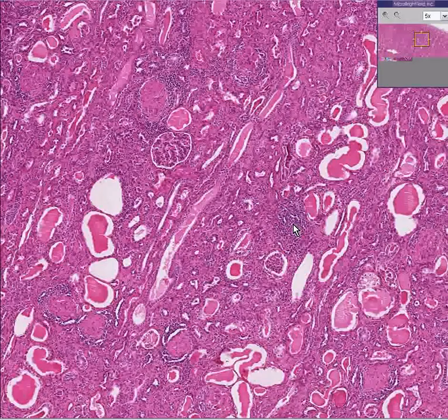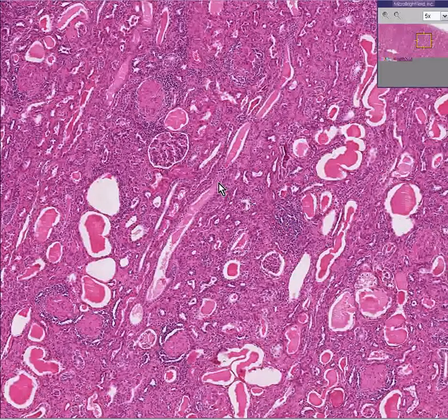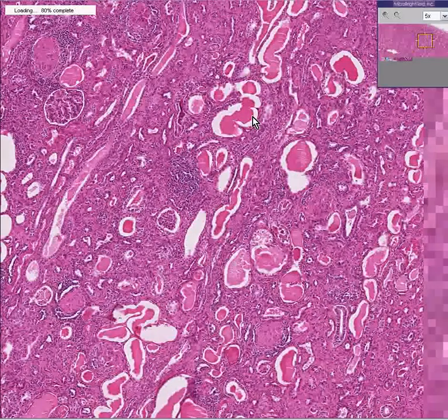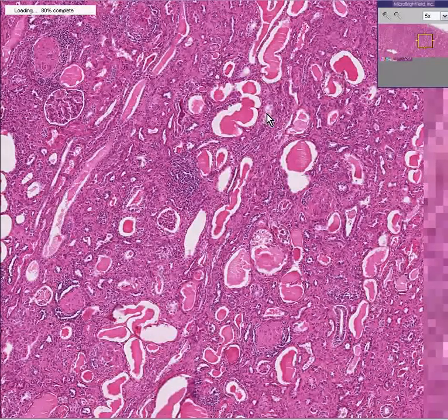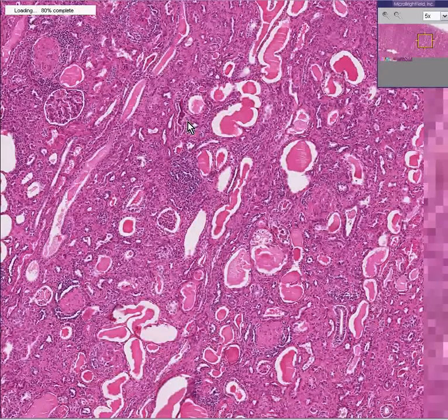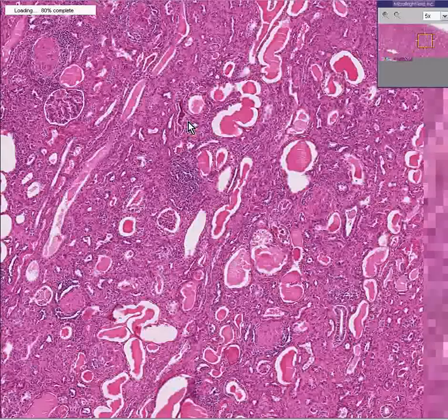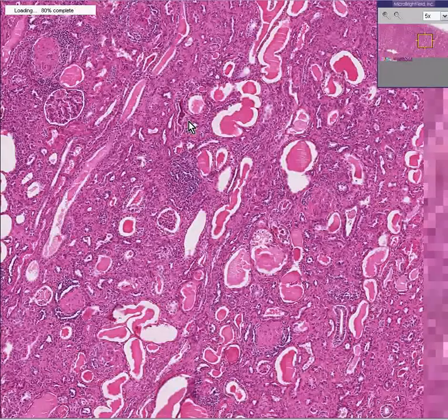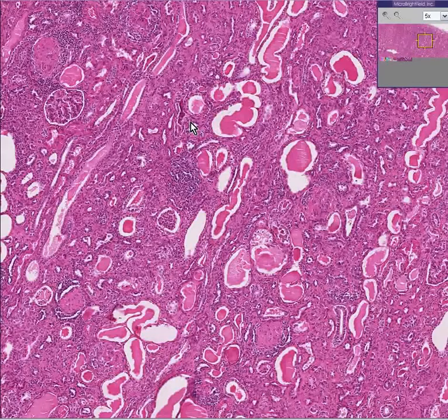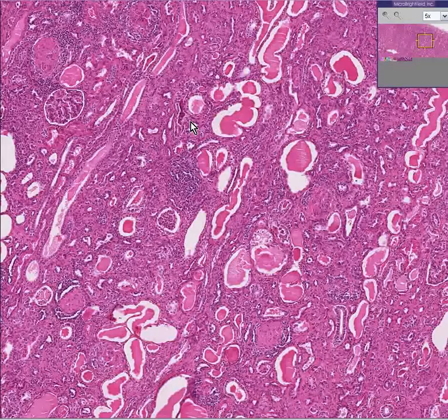Notice there are also scattered chronic inflammatory cells throughout the interstitium of the kidney, and the tubules are occasionally dilated and filled with proteinaceous material. This is a general wastebasket term for progressive glomerular destruction.